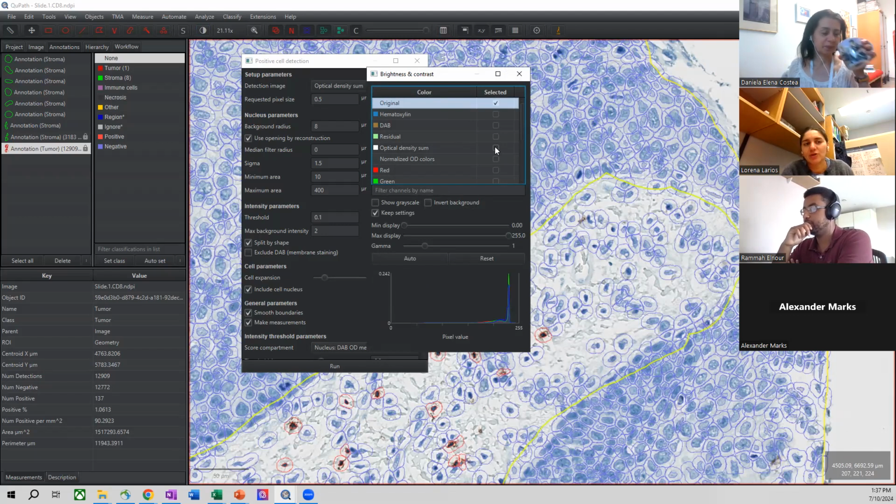Yes. I measure some spheroids, but I use ImageJ. Is it possible with QuPath to also measure a structure like that? Because in ImageJ, in the other program, I have to select the area of the spheroids, and then I will have the behavior during the time, right? In QuPath I can also do this kind of thing.